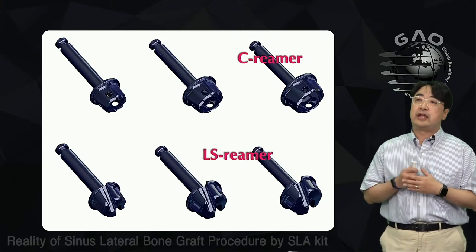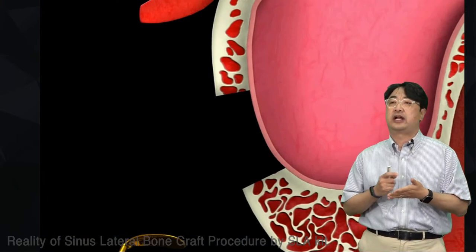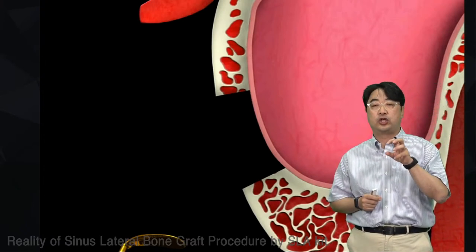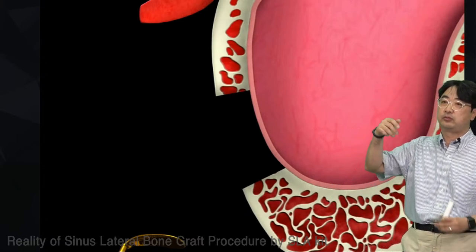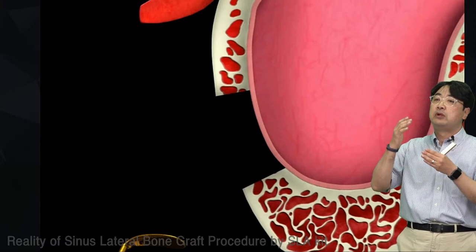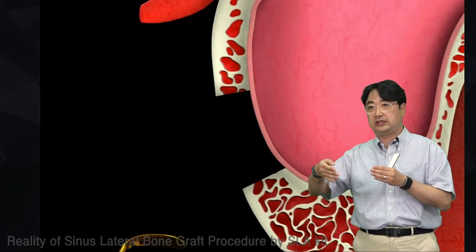Okay, so when you do the sinus graft, you have to do the membrane dissection, right? We call it the freer elevator, F-R-E-E-R, which means you make the membrane free. It acts differently from the curette. With the curette, you dig out, so you pull toward your body to remove granulation tissue or anything. But with the freer, you have to push. It's a big difference, right? You cannot pull it down, you have to push it out.